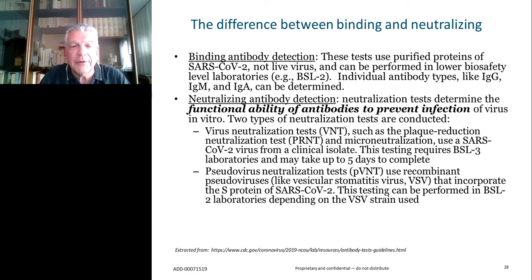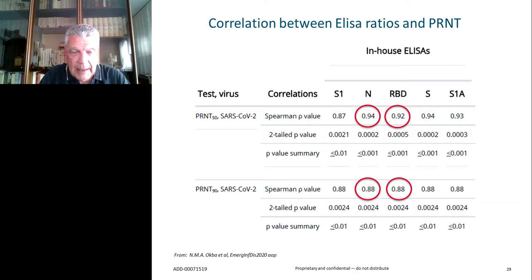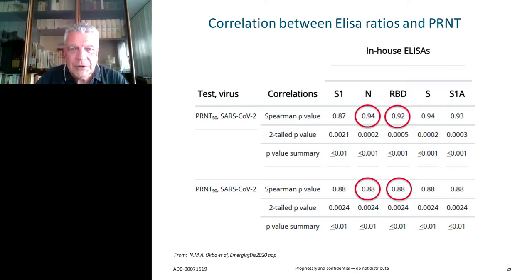What people would like to see is any degree of concordance or correlation between the binding antibody detection and the neutralization activity. And indeed, there is a bit of evidence on that we may share. The point of having a correlation between ELISA ratios and neutralizing activity has been raised and demonstrated in quite a few evidences and independent papers.